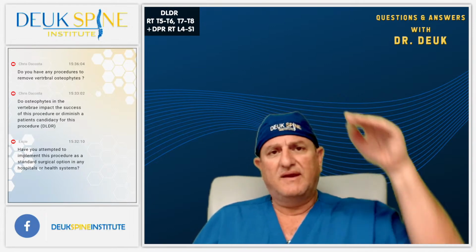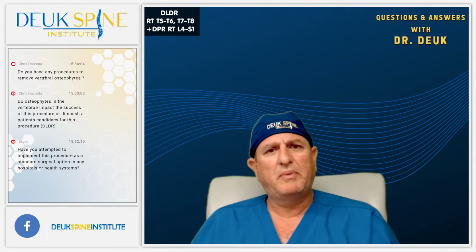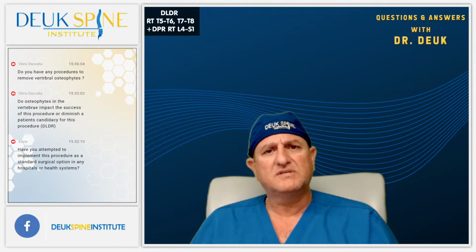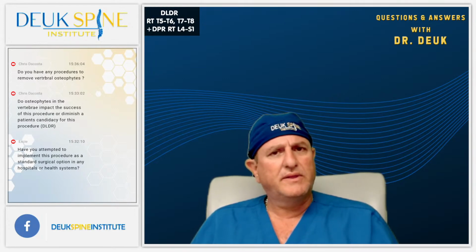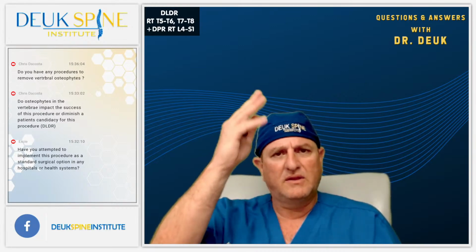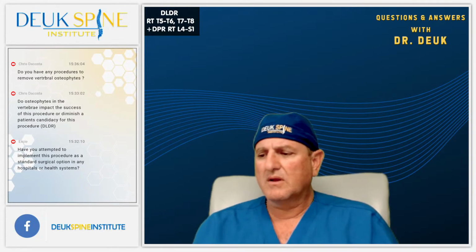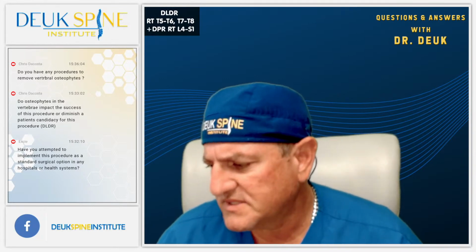That said, when I asked her during surgery, do you have pain up here at T5-6? She said, no, I don't really have minimal pain there. So we're going to see how she does, but we fixed one of the two discs, 7-8, in the thoracic, and it went very well. She clearly had a big tear there. It was a lot of blue stuff. It stuck in the tear. We cleaned it all out. I feel good about that. And then we went down and we did our Deuk plasma rhizotomy.